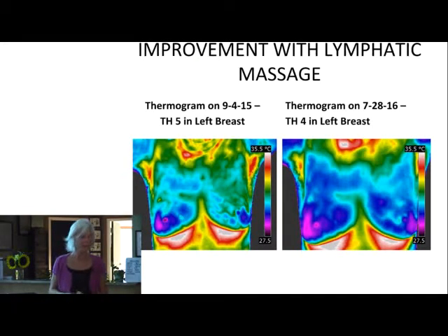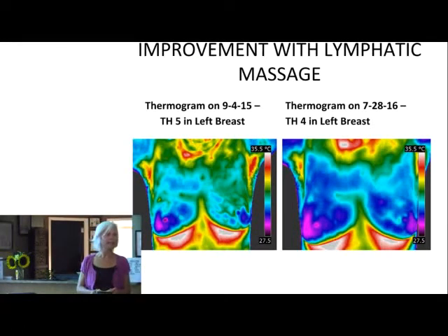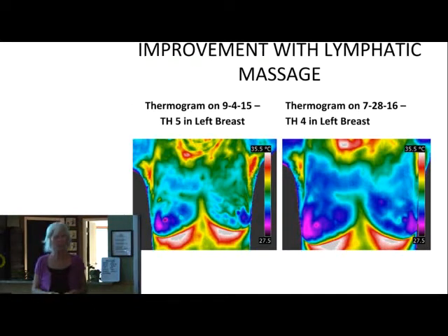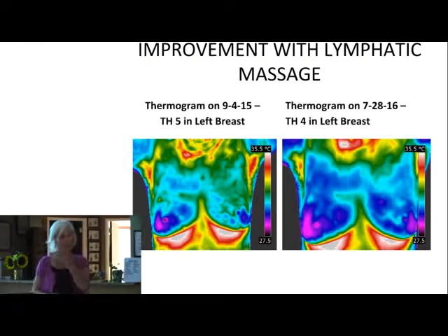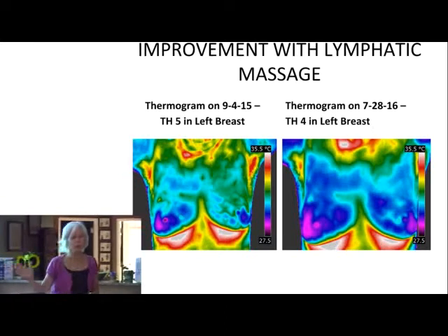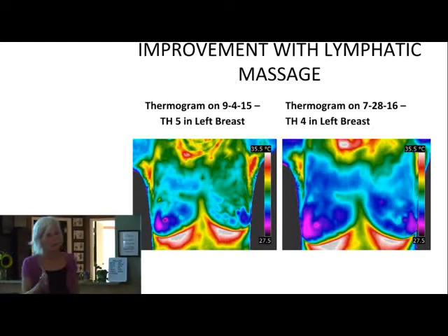So obviously, when I mentioned earlier how important lymphatic drainage and lymphatic massage is, this is a visual that shows you how important it can be. For this woman, it worked. She needs to add on, because she's still above average. 4 is above 3, which is the average risk rating, so she still needs to do more. But she knows if she continues with this lymphatic work, that 4 is going to go down to a 3, and then hopefully from 3 she goes to 2, which is below average.